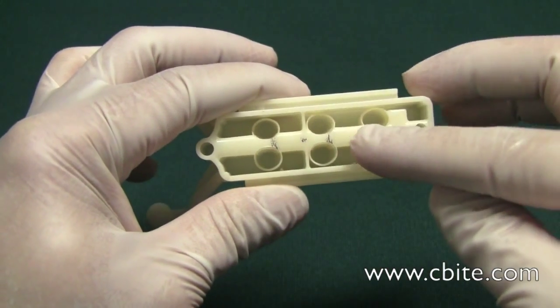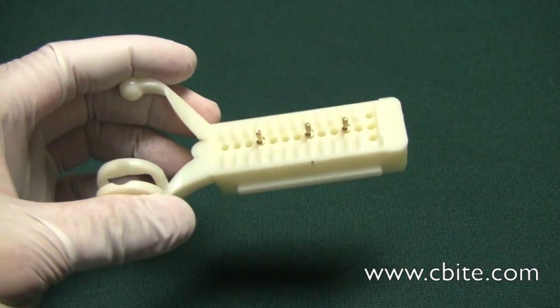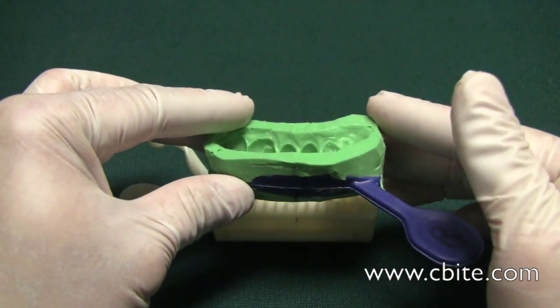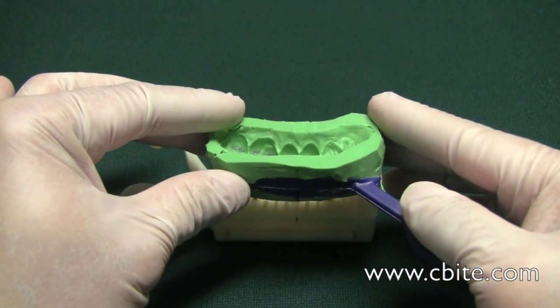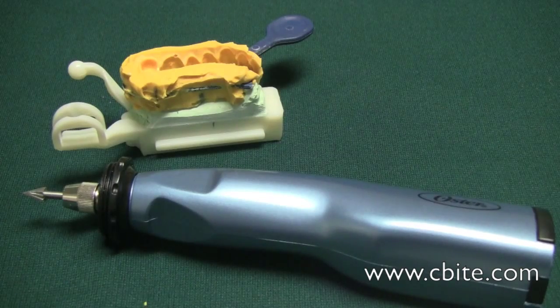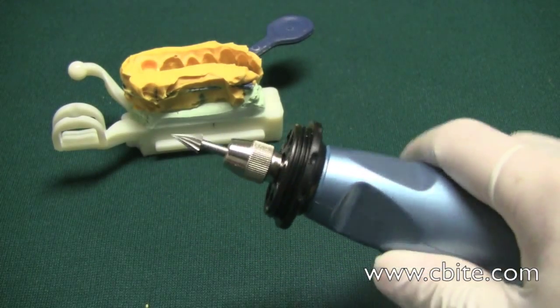Now I know where the ejector pins are going to go. At this point, all I need to do is pour this model up. Once it's all poured and the stone is set, that's when we're going to make those holes at the bottom. To make the hole, you're going to need a Dremel handpiece or a lab handpiece.